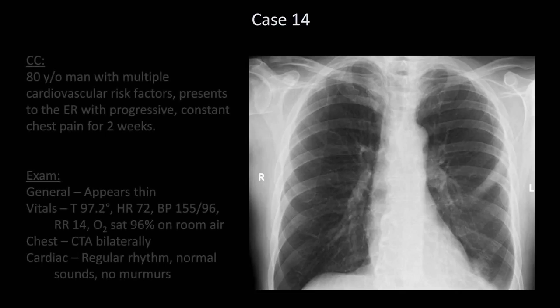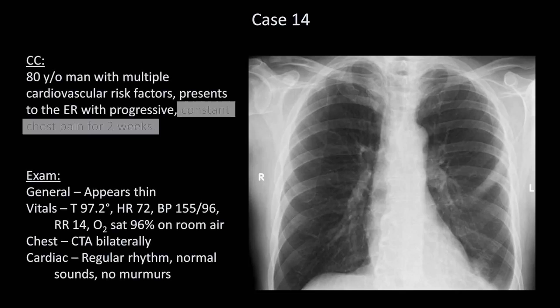So what's the problem? It's this. This patient has had constant chest pain for 2 weeks. Assuming that history is accurate, there is no way this patient has acute coronary syndrome. Ischemic pain typically lasts from minutes to hours, and I've never even heard of a case of constant ischemic pain lasting for more than a day.